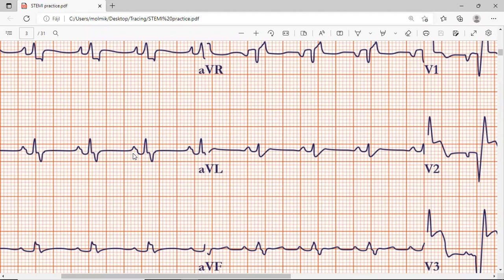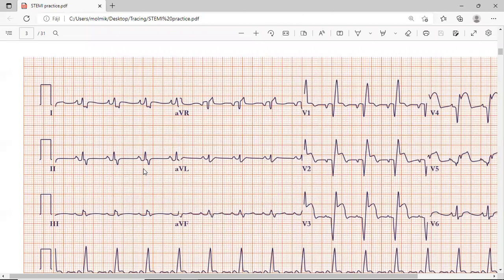Another thing, ECG is not the best tool to diagnose hypertrophy. Maybe you do see the signs. So if you say that due to the notching of the P wave it can be a left atrial hypertrophy, you have to use ultrasound to prove it. That's it, okay? So it's not tall, not wide. I won't see any changes of this P wave.